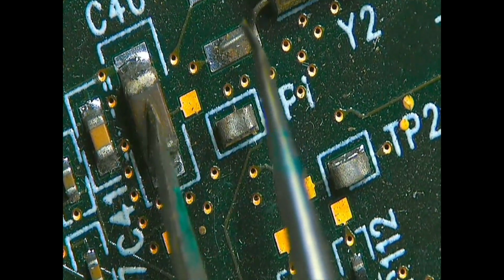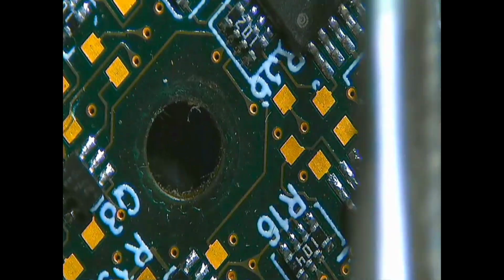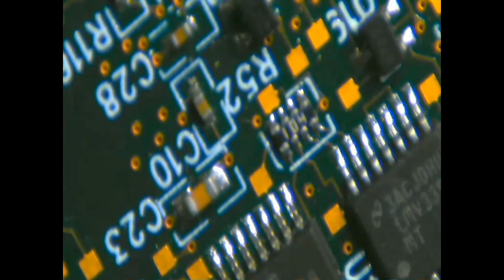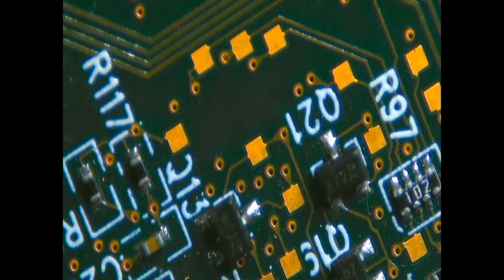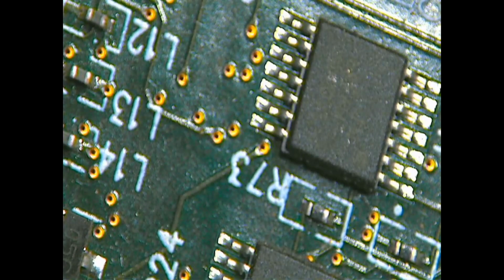But this capacitor has a little bit of color changing, so we can check it later. Opposite side we are looking now. It's clean. Clean. Clean. So what would be the issue? That's the thing we should check with the multimeter. So I'm taking my multimeter out and let's see what is happening there.